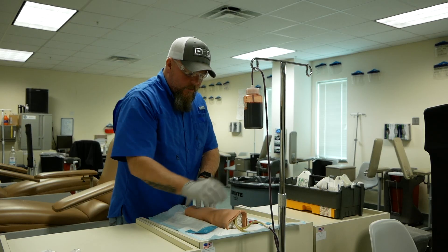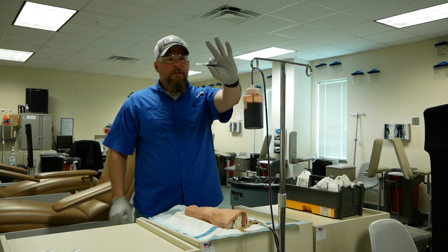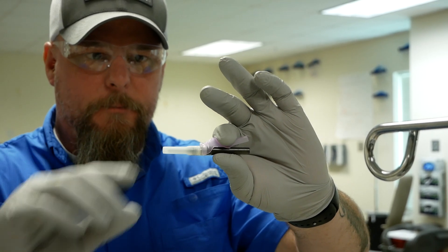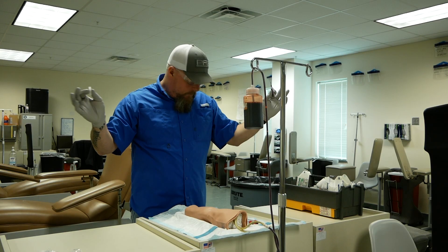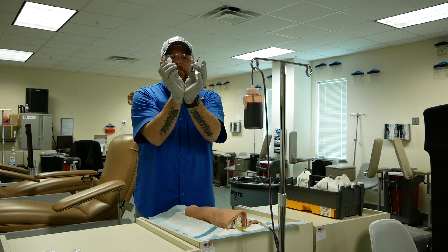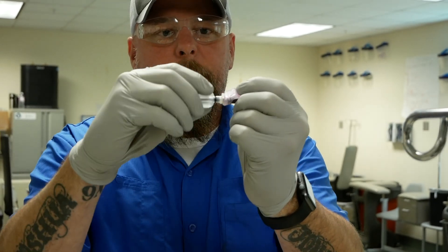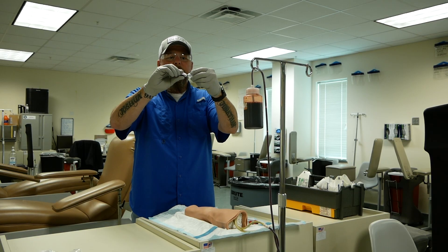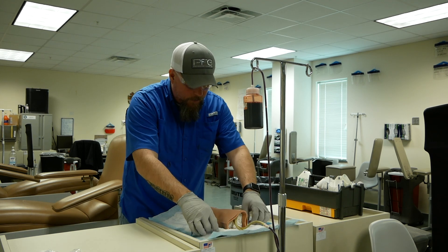This is where we're going to assemble our needle and vacutainer holder. You're going to pick your needle up in your non-dominant hand with the pink safety cap on top and squeeze the pink and the black. Twist the clear to break the tape and take your cap off. Throw that clear plastic away. Grab your vacutainer holder and go wrist to wrist, then spin everything around so the gray needle goes into the small hole. If you're right-handed, twist away from you; if left-handed, twist toward you. Once assembled, set it down and reapply your tourniquet.